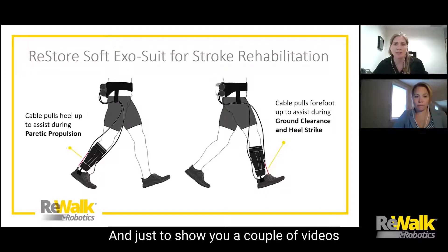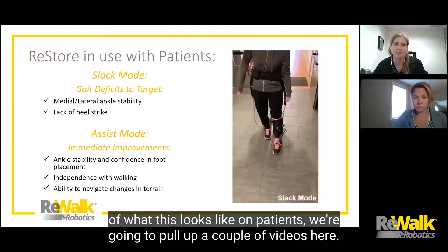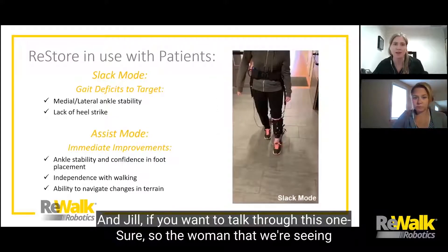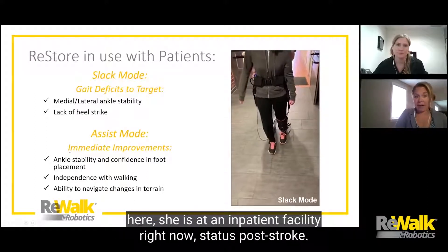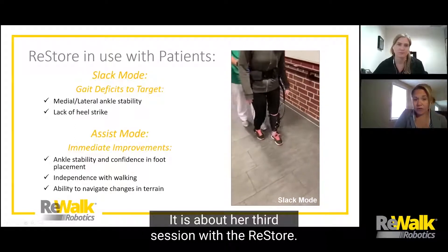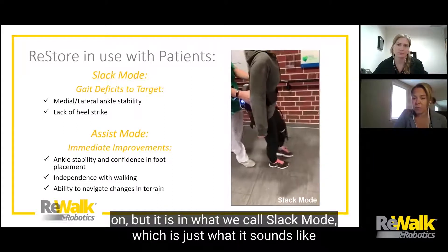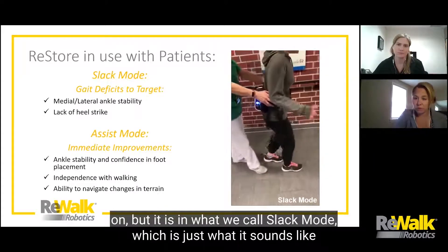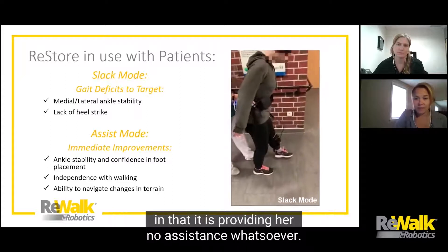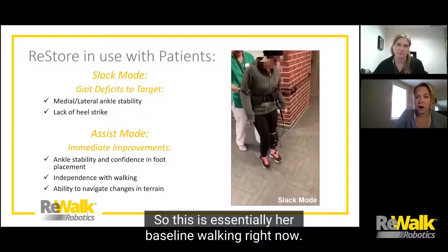We're going to show a couple of videos of what this looks like on patients. The first patient is at an inpatient facility, status post stroke — this is about her third session with the Restore. We see her here with the device on in what we call slack mode, which means it is providing her no assistance whatsoever. This is essentially her baseline walking.